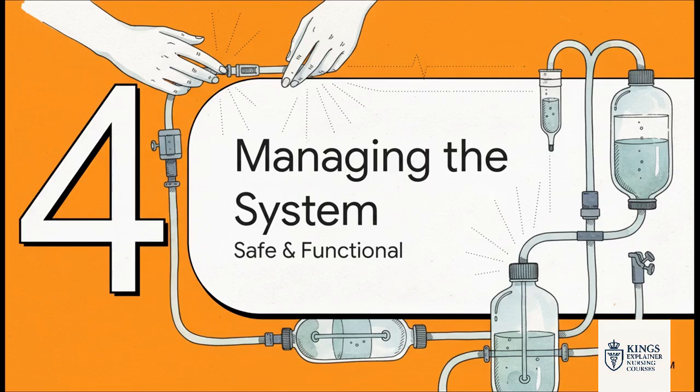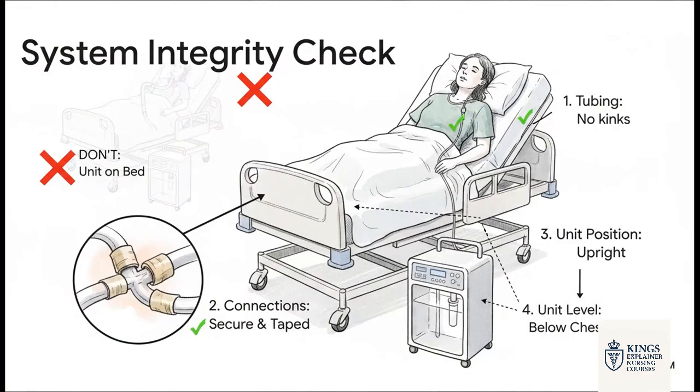You've assessed your patient, now it's time to focus on the hardware. You have to think of this drainage system as your patient's lifeline. It's your job to make sure it's working correctly and safely. So, here's your system integrity check. 4 things, all super important.